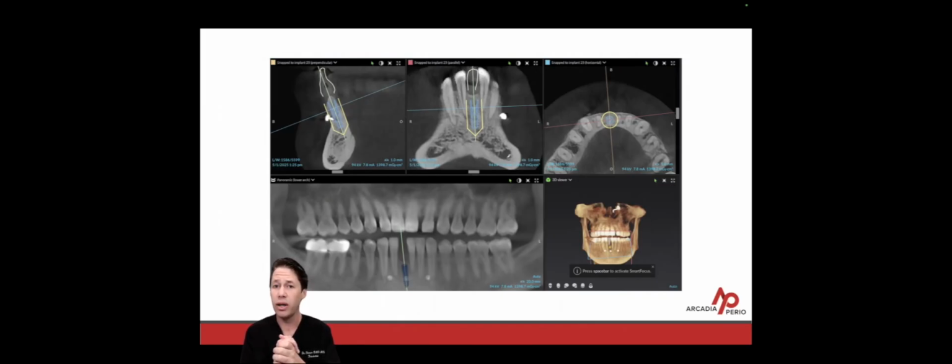So again, if you want more information about the DTX digital workflow and how I incorporate this, jump over into my Modern Periodontal Concepts and you'll get to see a step-by-step tutorial about how I actually do this chairside with the patient. But for now, just know that with the intraoral scan and DTX Studio, I design a tooth. So now I'm doing a restoratively driven treatment plan.